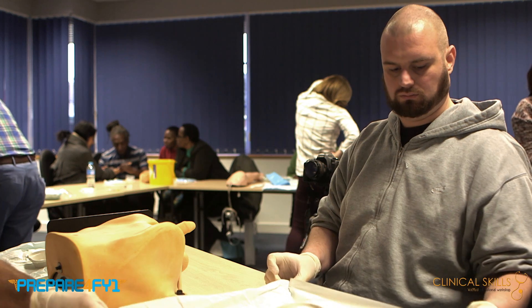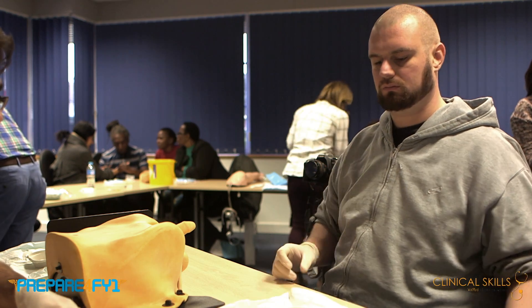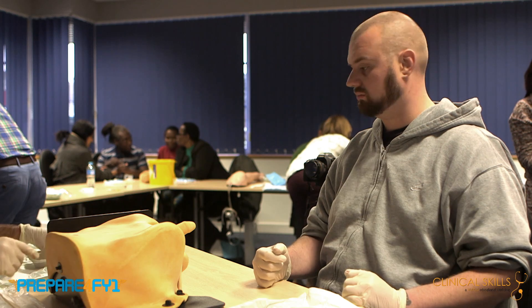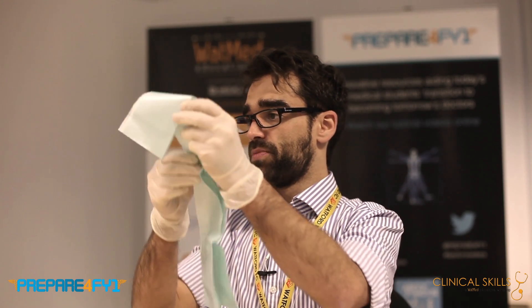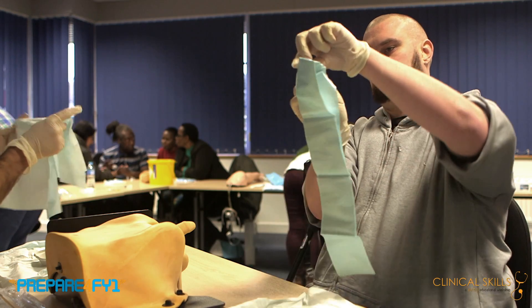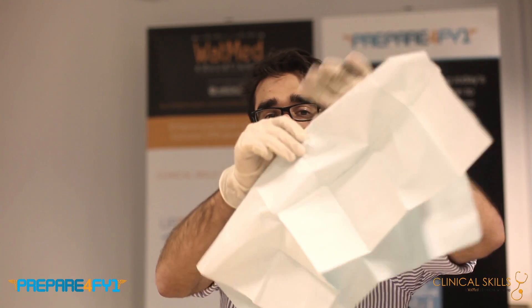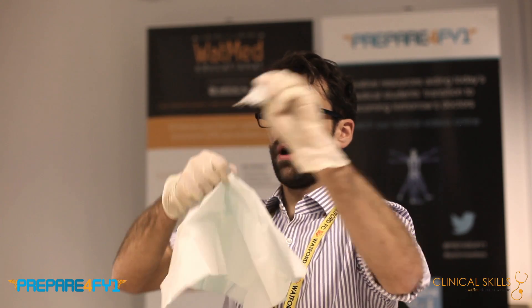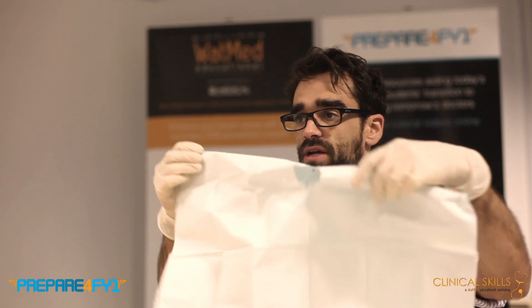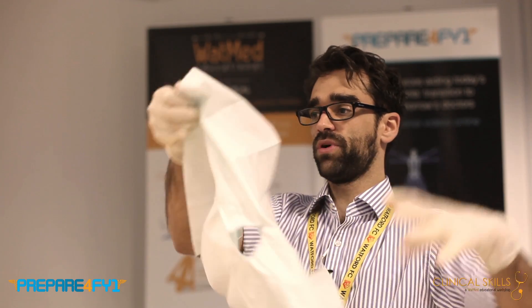If we just straighten this out onto the table so it's nice and straight — just like if you're scrubbing in theatre, you'd want it nice and flat. Take out the drape from your bags and unfold it, because there's no hole in it. Then you put a hole in the middle and discard that piece away from your sterile field — do not leave it on your sterile field. Once you've put the hole in it, you can fold it up again.